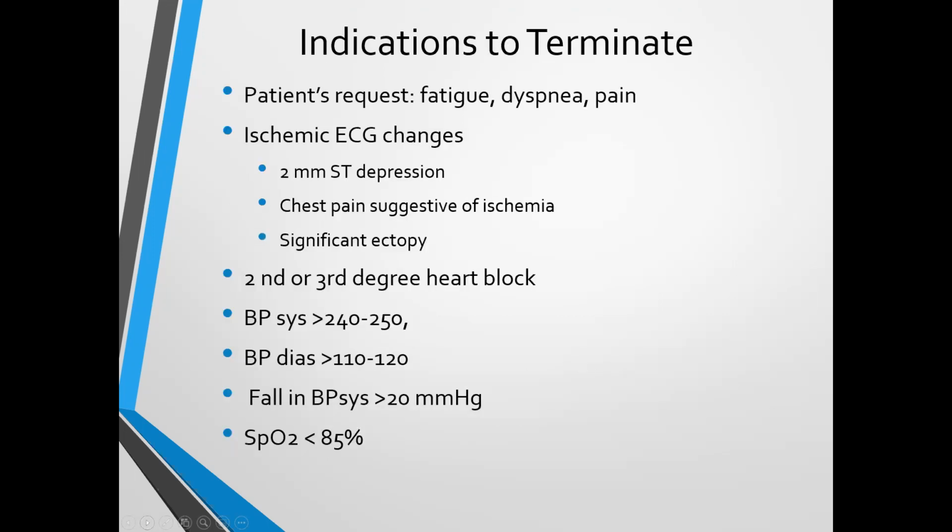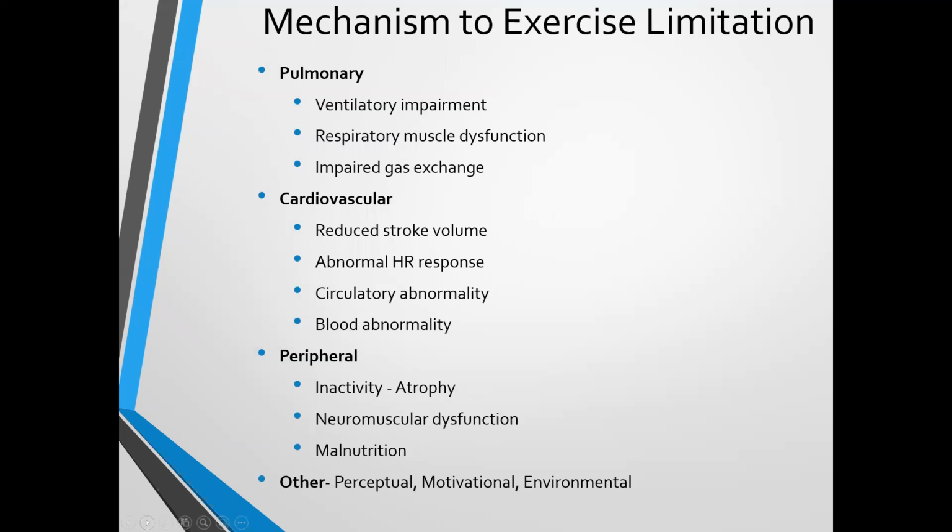Indications to terminate. Again, many of these would be what you would suspect. Patient requests: they're fatigued, "I can't breathe," and not a little out of breath, because you would expect the patient to be a little out of breath. It's "I can't continue." Ischemic changes, so things like ST depression, chest pain suggestive of ischemia, significant ectopic heartbeats, so where there's something going on in that department. Second or third degree heart block, no bueno. And then you could see some of your blood pressure measurements as well as your saturation measurements.